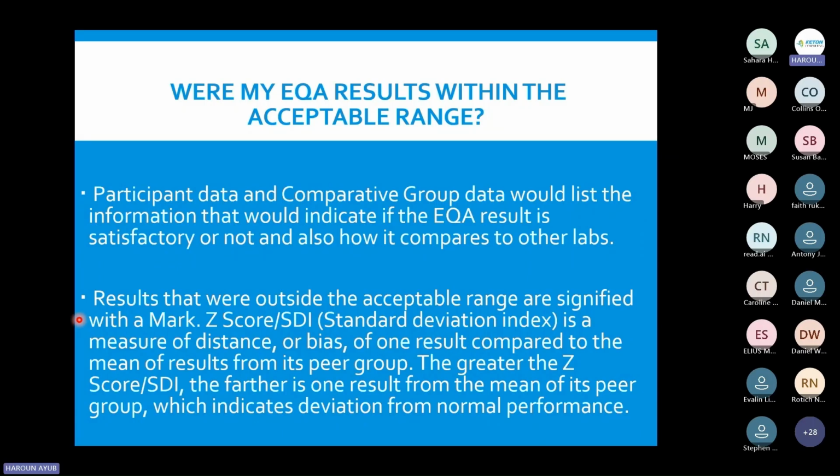If general has a Z-score of 3, instrument has a Z-score of 0.5, method has a Z-score of 0.1, and reagent has a Z-score of 1.5, will you consider your results as a fail or a pass? You'll be able to see which peer grouping or hierarchy is best characterized for you, and see that there is no alert signal on the left side of your EQA if the other groupings are okay. So the instrument is the best characterized group for you.